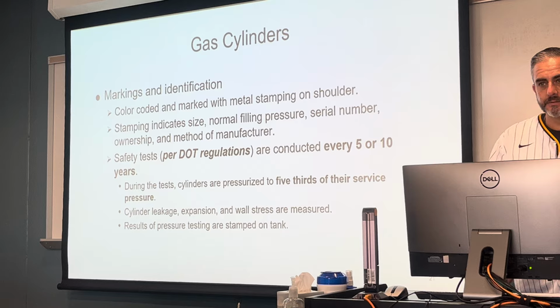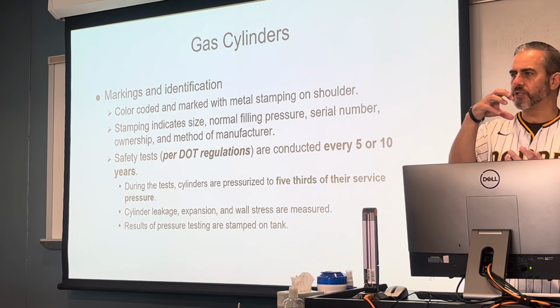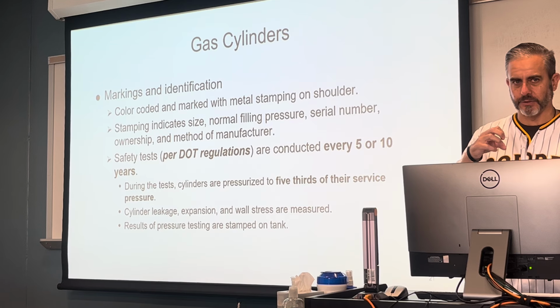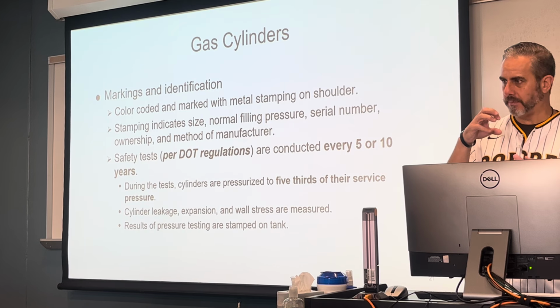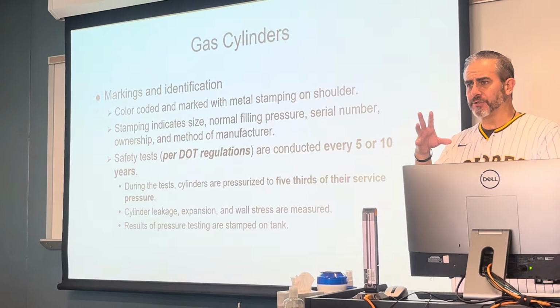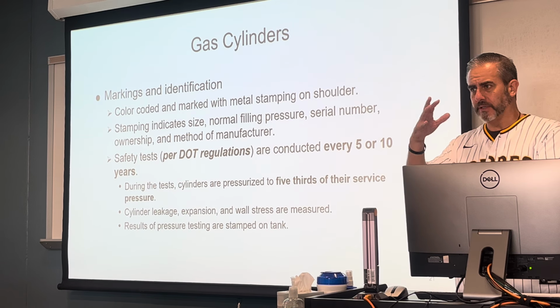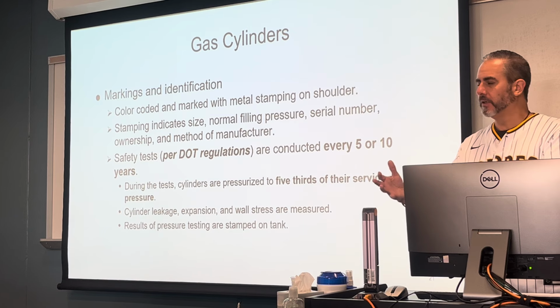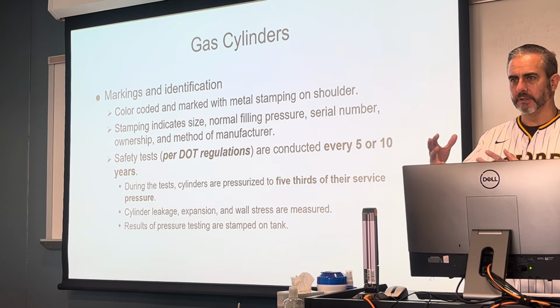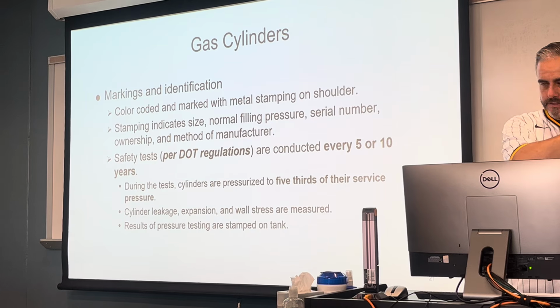During the test, these compressed cylinders have compressed gas inside under extreme pressure, right? That's where the danger and the hazards are. What if this thing was to fall or bust or the top of it shear off? What's going to happen with all that pressure? All that gas is going to try to escape and the tank's going to go taking off on us.